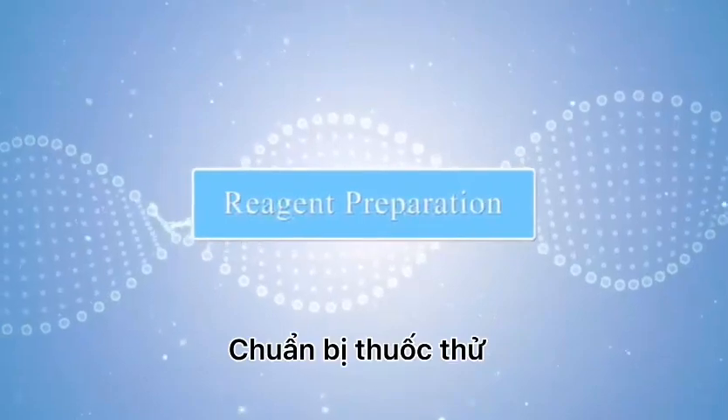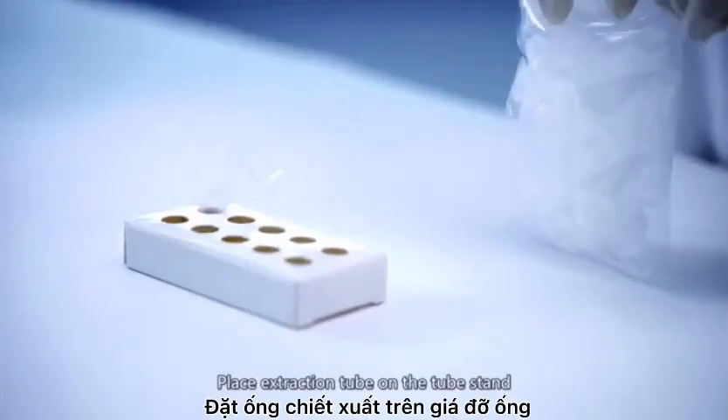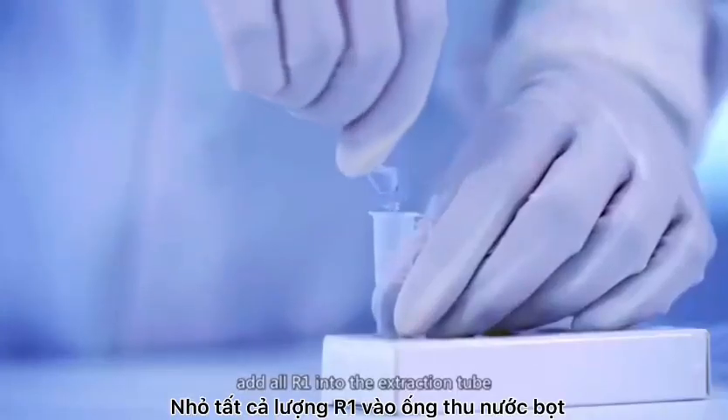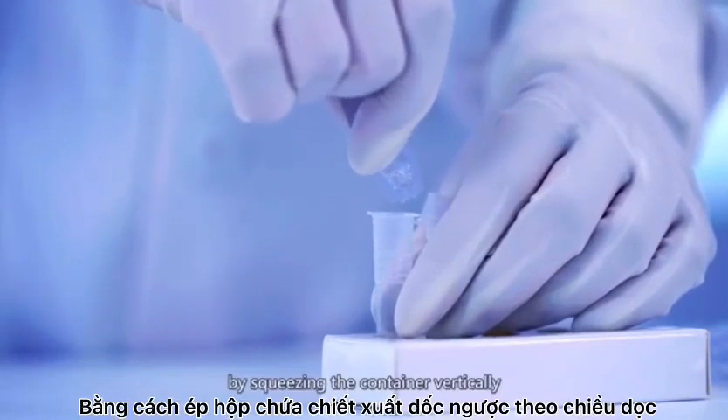Reagent preparation. Place extraction tube on the tube stand. Twist the tip to open the R1 container. Add all R1 into extraction tube by squeezing the container vertically.